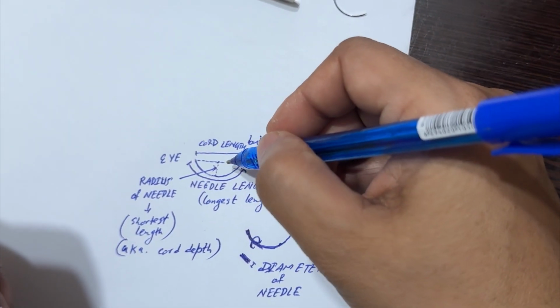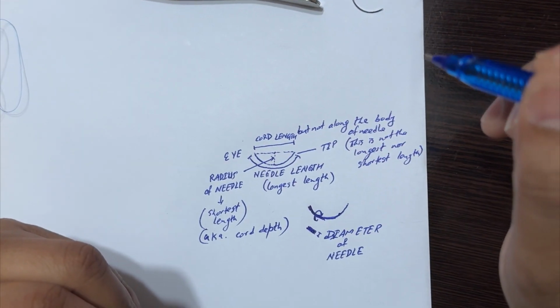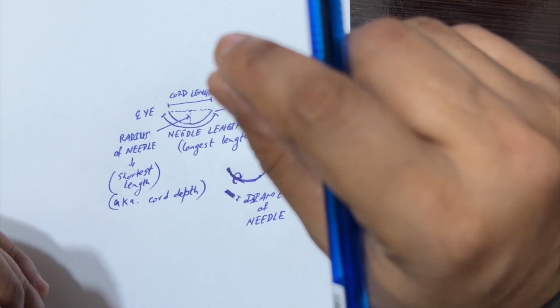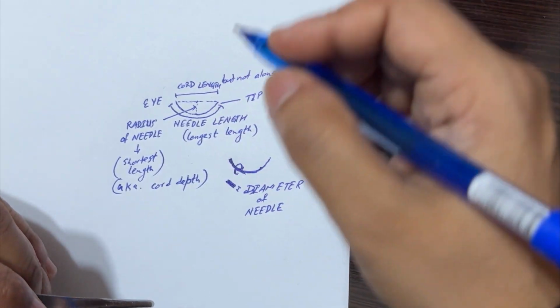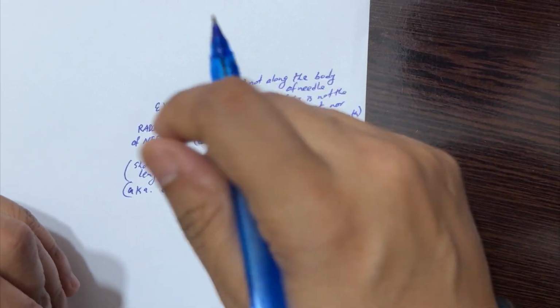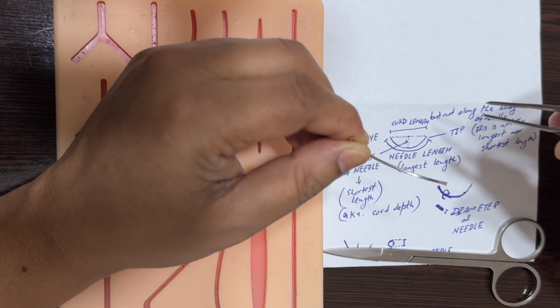So I'll explain it once again after that. For this reason, the radius is necessary outside the body. But whenever we pass the needle through the tissue, one small gap is created, or trauma is created, in between the cells, right? So that is why the diameter of the needle is needed along the body of the needle.